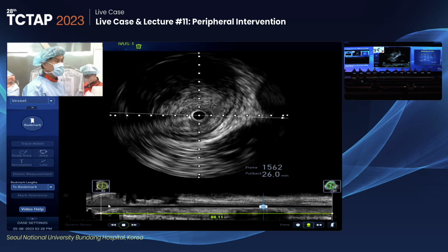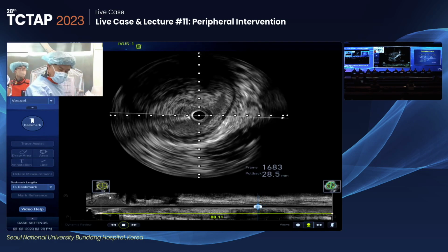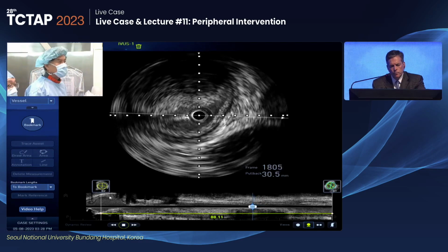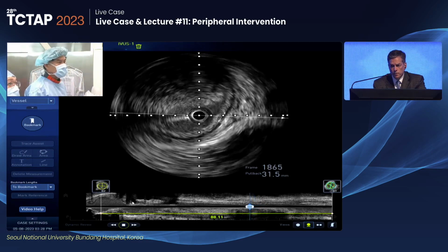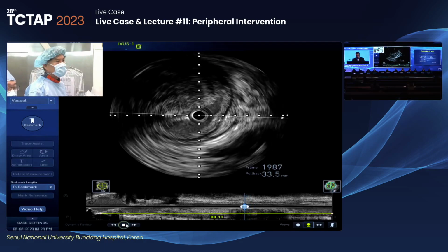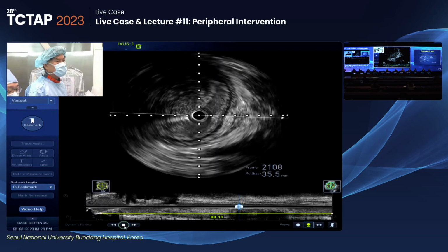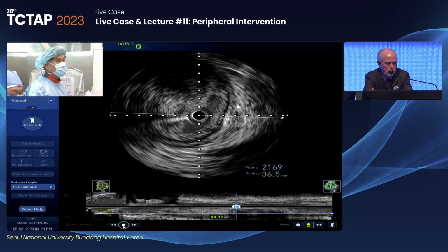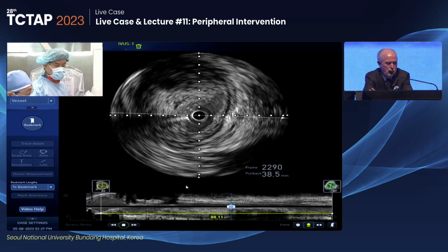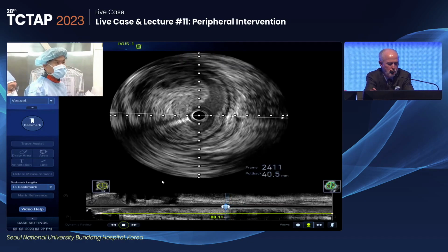Please discuss what I have done now. So now that you've connected those, and you've pre-dilated, are you going 4 millimeter pre-dilation? Can we see the IVUS back to the internal iliac artery? It looks like your true lumen the whole way, but just want to... I felt it's almost intralumen. And the next stage, I'm planning to do the 6 millimeter, 8.